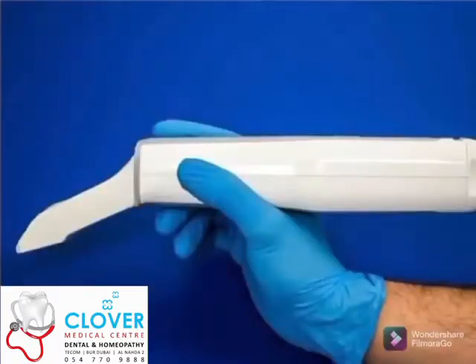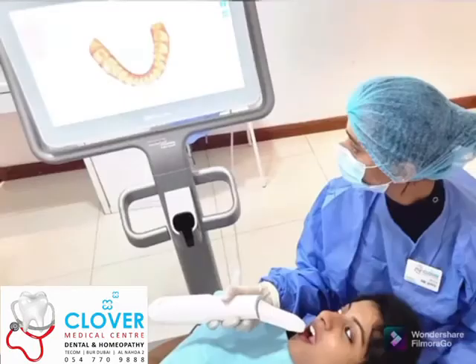Now the iTero has two parts, the wand and the station. So the wand is an intraoral camera that is moved around your mouth and it records the images and processes it. And the processed image is then displayed as a 3D image on the screen, which you can see as it is being recorded.